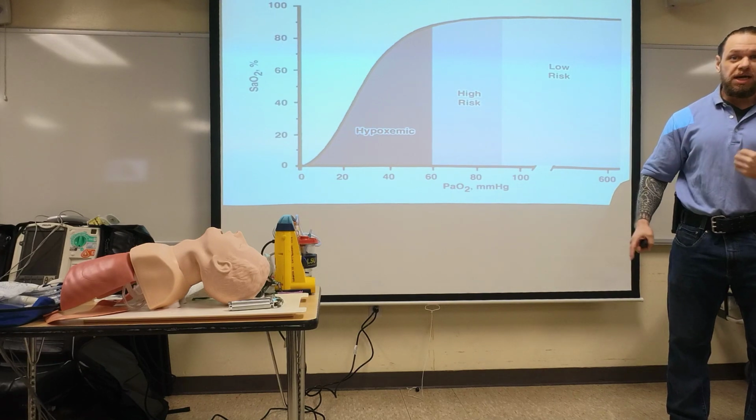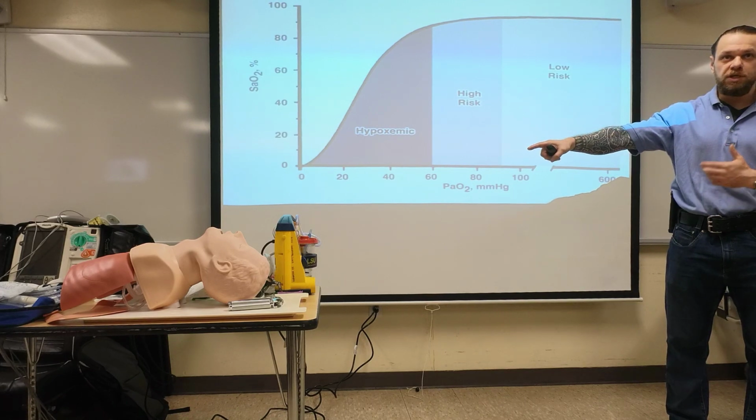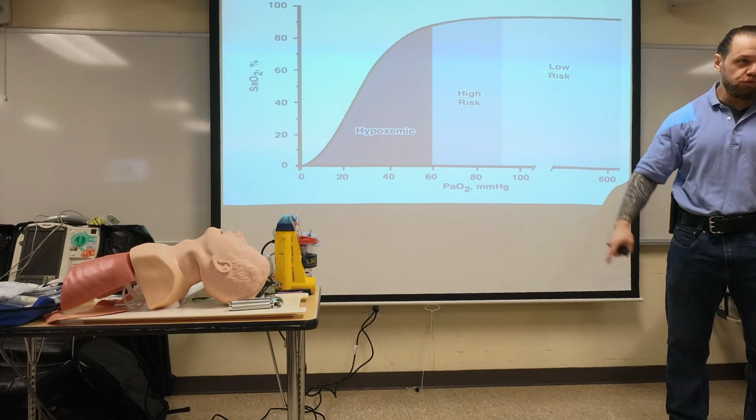This buys us time. If you give them a couple of breaths, 30 seconds in, their pulse ox is 100, you still did not fully remove all the nitrogen. That's why we do it for 2 minutes. You guys understand that now? Right? So 2 minutes.